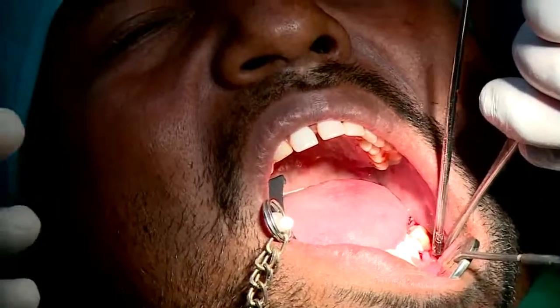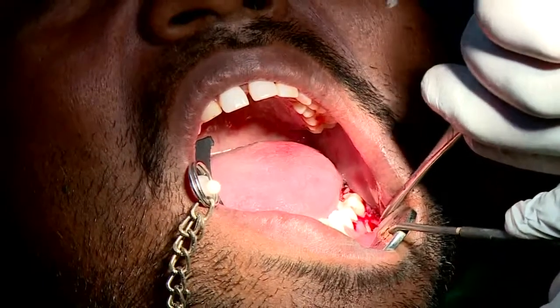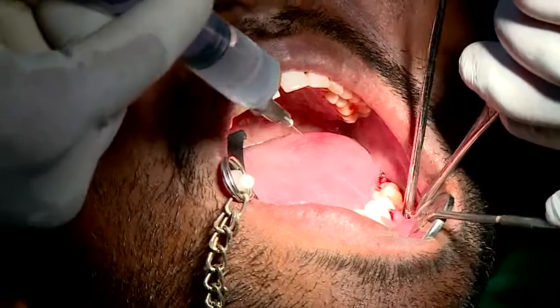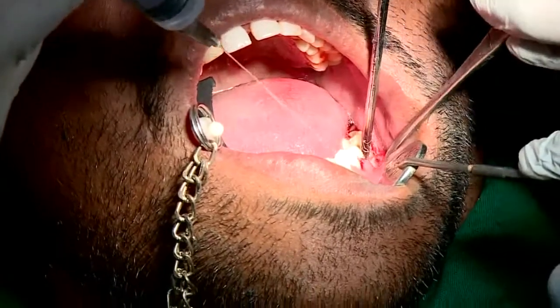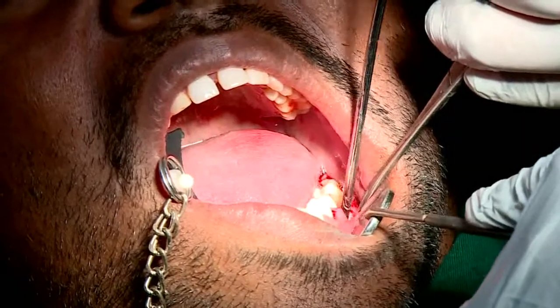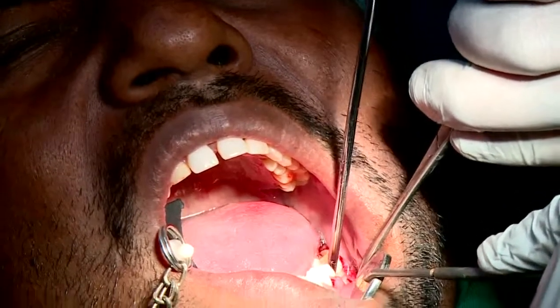Closure, in this case I am just going to do simple interrupted sutures. We are going to use a silk suture. We can get rid of it in about a week to 10 days' time. The patient will be placed on a standard set of antibiotics. If you ask me whether it is mandatory, because we have perforated the bone, I would probably still use it, at least for a period of about 5 days. I will give a simple broad-spectrum antibiotic like Augmentin or amoxicillin. That's what I normally use.